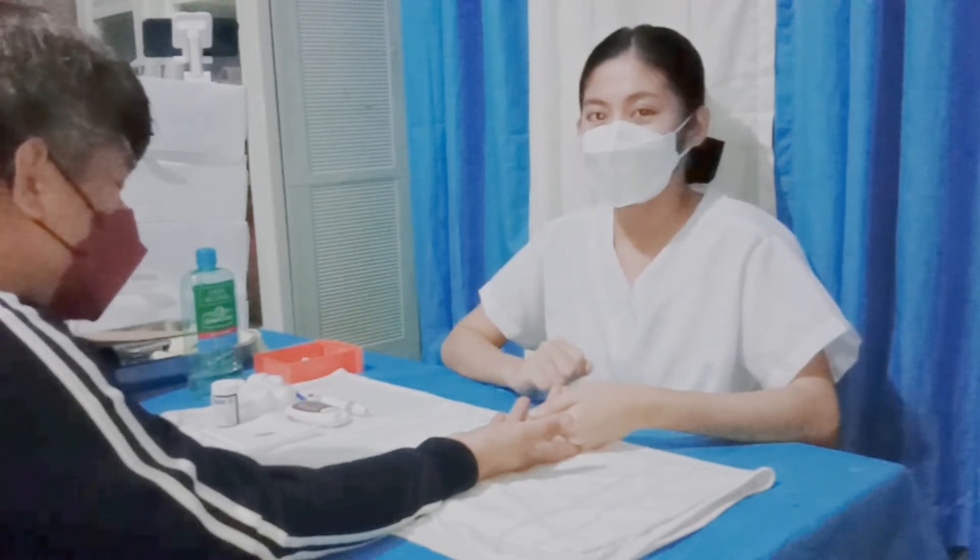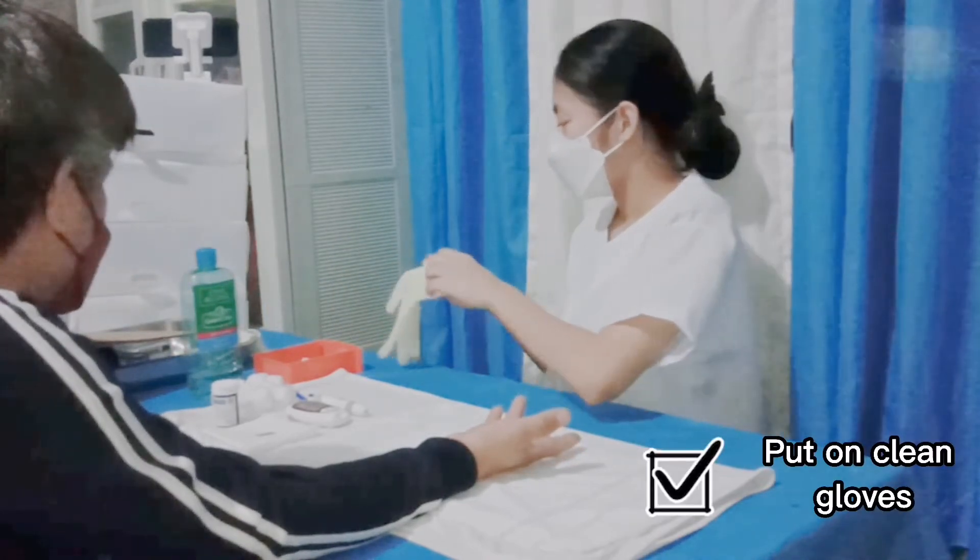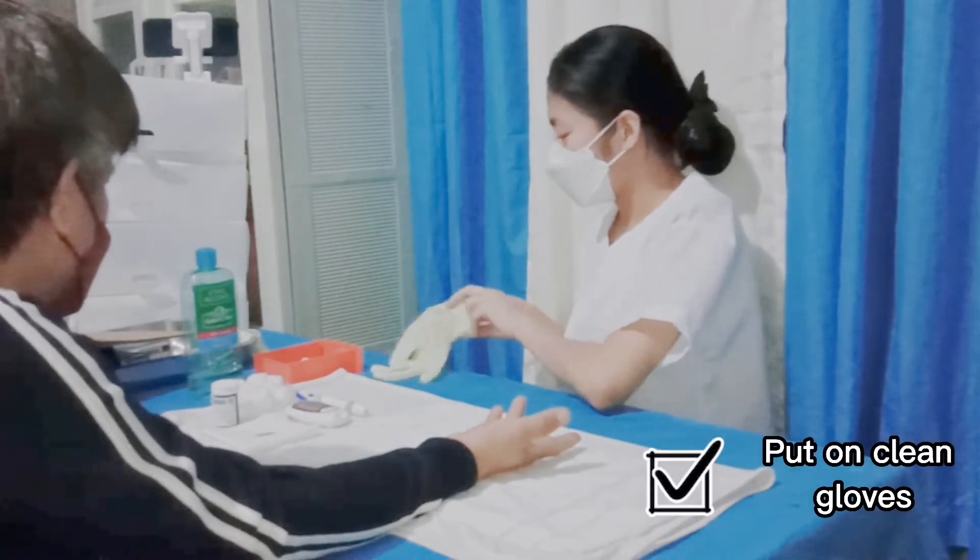After cleaning the site, we are now going to proceed with obtaining the specimen. But first, we have to wear gloves.